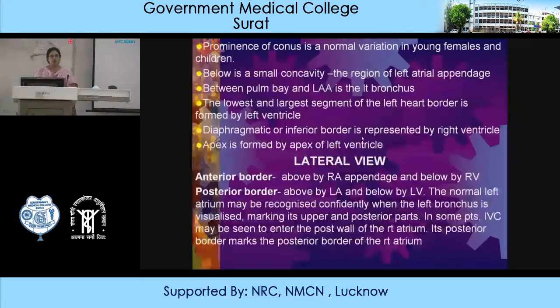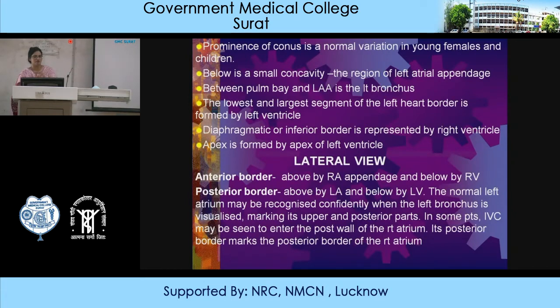Prominence of the pulmonary conus is a normal variation in young females and children. Below this is a small concavity formed by the left atrial appendage. Between the pulmonary bay and the left atrial appendage is the left bronchus, which helps differentiate the upper boundary of the left atrial appendage. The lowest and largest segment of the left heart border is formed by the left ventricle. The diaphragmatic or inferior border is represented by the right ventricle, and the apex is formed by the apex of the left ventricle.